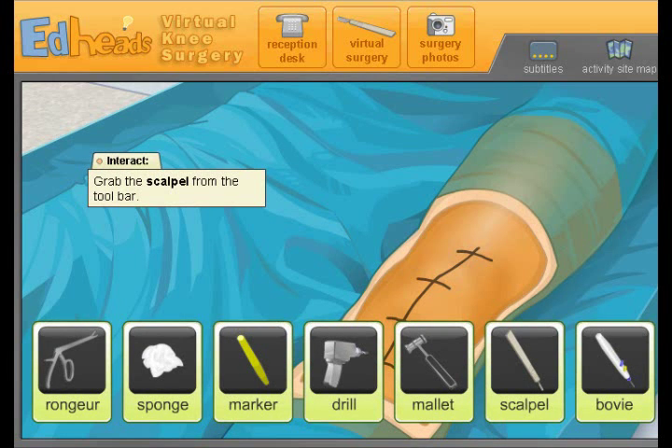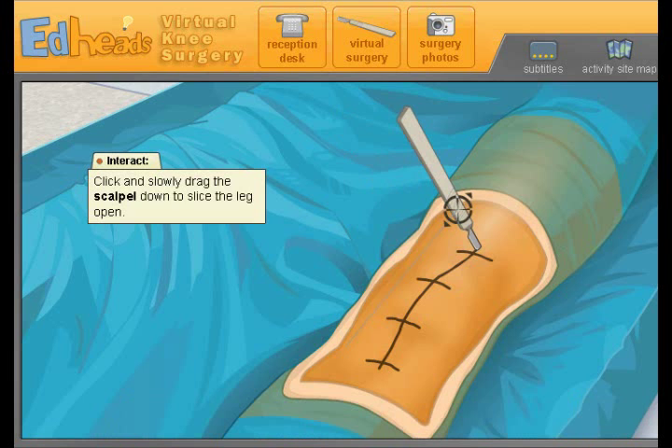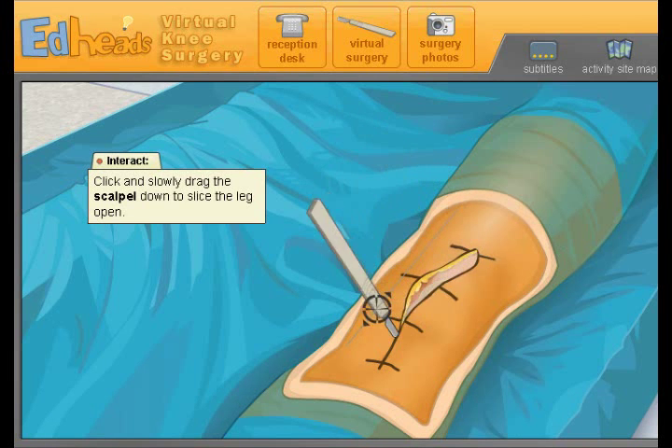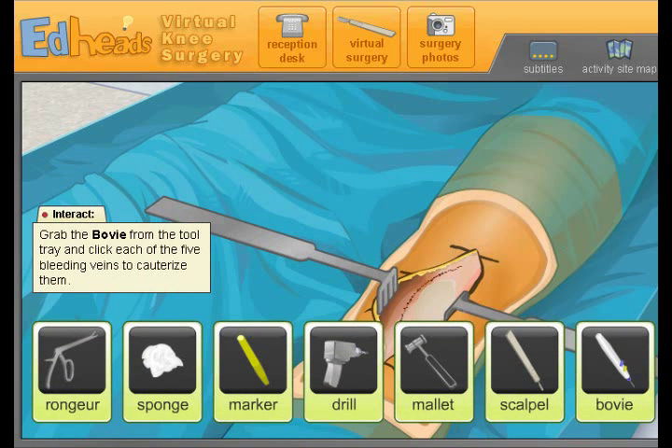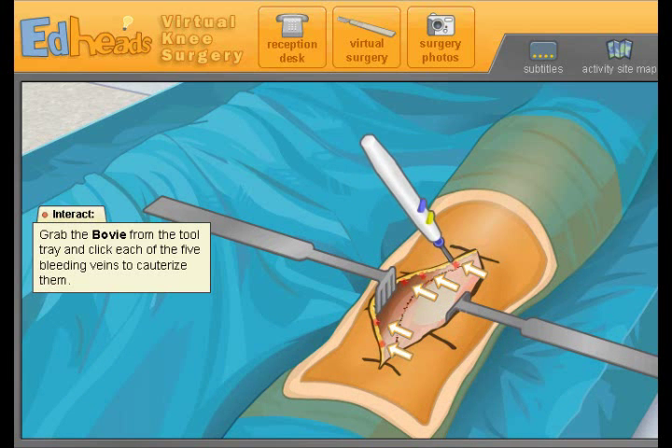Now for the incision — take the scalpel and cut the skin following your markings. Alright, now here comes the surgery part. Ready? Eww — let's use the bovie pencil to cauterize the veins. This will help decrease blood flow into the surgical field. What's that yellow stuff? Yeah, I think that's maybe fat. Now we're going to cauterize his stuff to prevent blood flow.